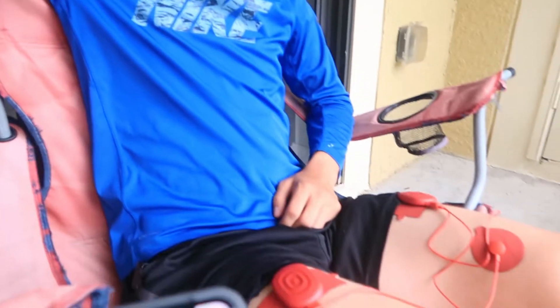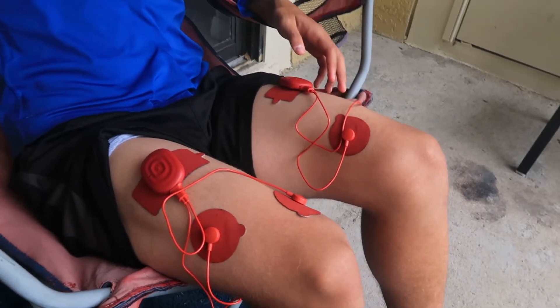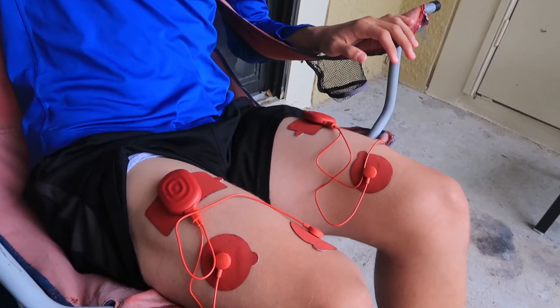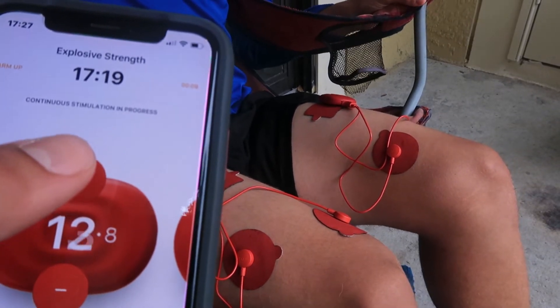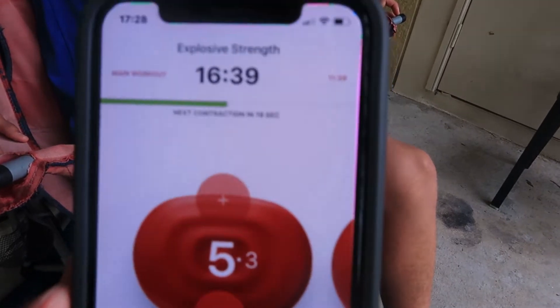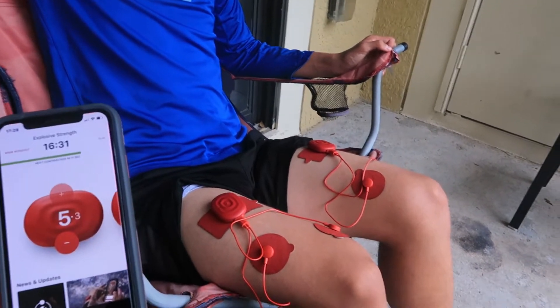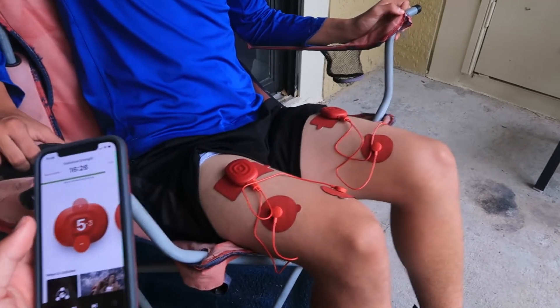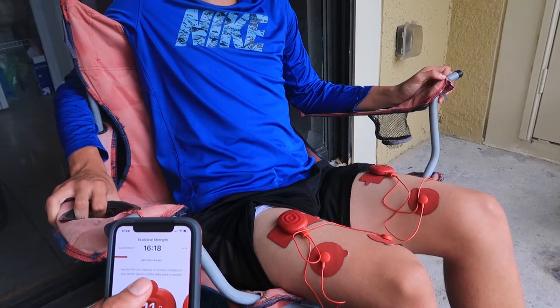So you've got one minute... It's like when you get tired and you just want to stop and breathe. 15 minutes — is it still going? Yes, it's a little hard. Now he's on a rest — you see that green bar at the top — it's going to say 'next contraction in 15 seconds.' When those 15 seconds come, it's going to hit him with a big burst of electrical stimulation and you're going to see his legs just jump up. Watch — ready, here we go!